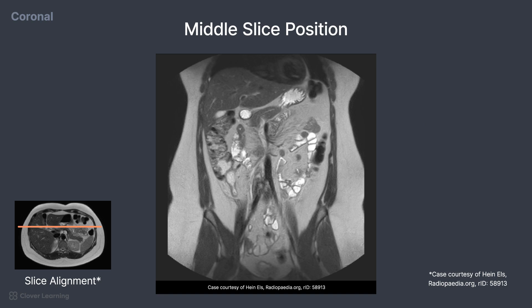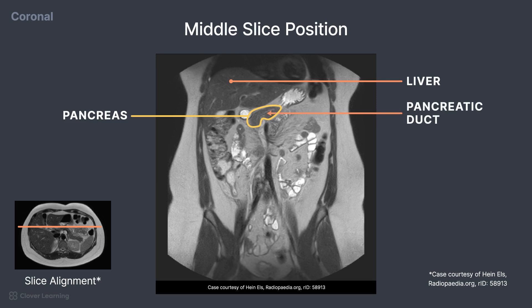A small structure on this image is the pancreas, which is located right in the center, just underneath the liver. You can see a faint white line indicating the pancreatic duct.